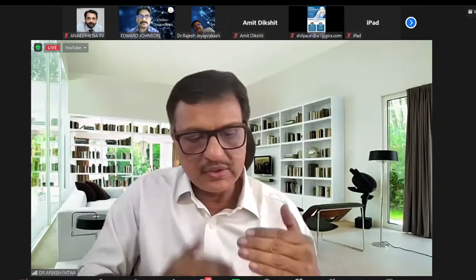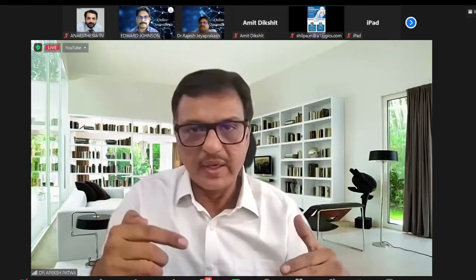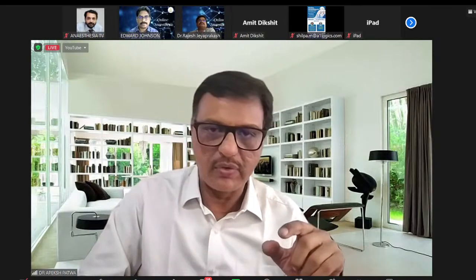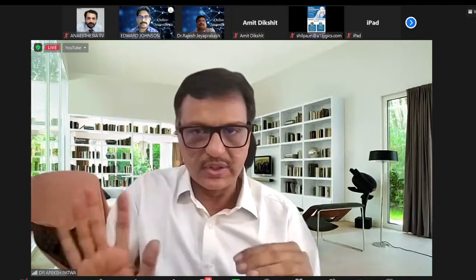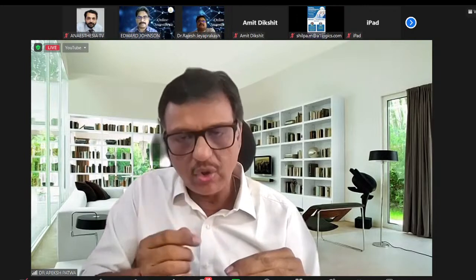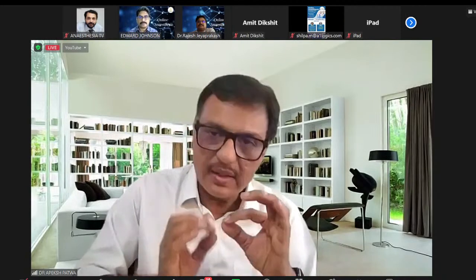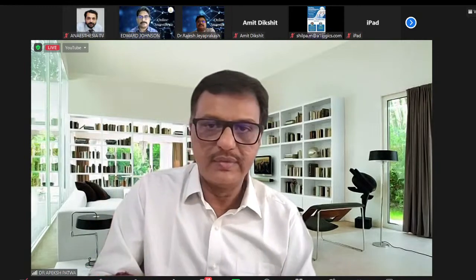See, there is a disparity of angle between the video laryngoscopic blade and the direction of the trachea, and that creates the problem. So if you try to pass a stiletted tube, it's going to hit the anterior part of the trachea. So what you should do is take the tube up to the larynx, don't insert it inside. Don't go into the larynx, don't go into the vocal cord. Withdraw the stilet 1 to 2 centimeters, keep the stilet there, and then advance the tube. That decreases the chances of failure.